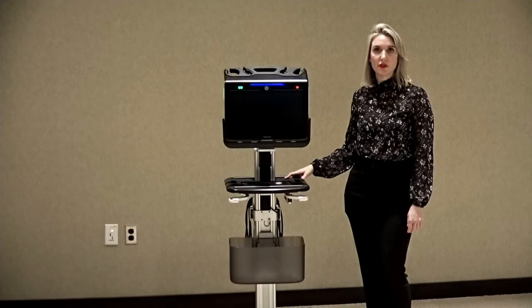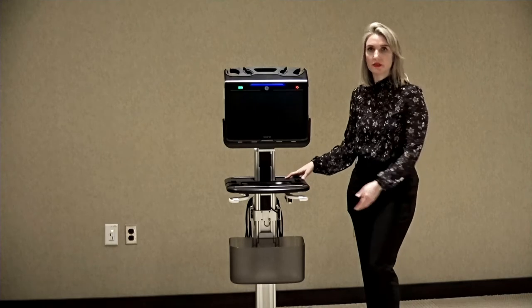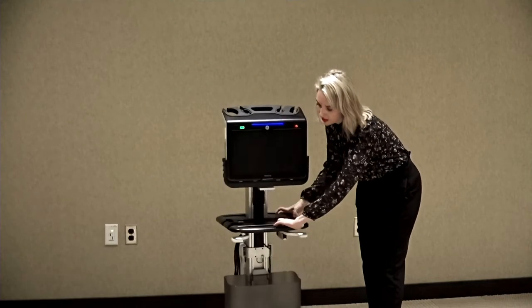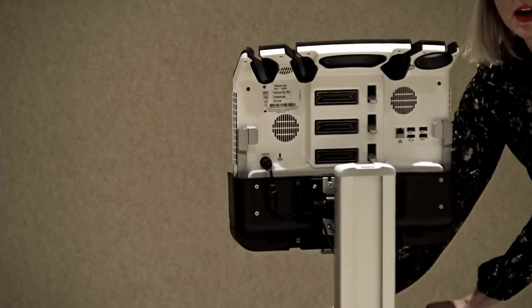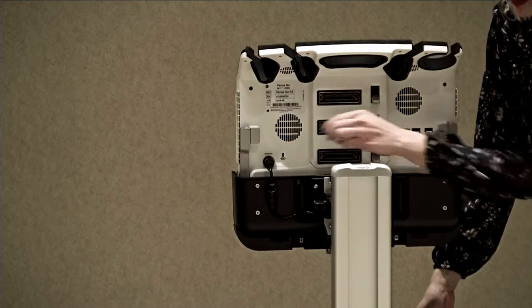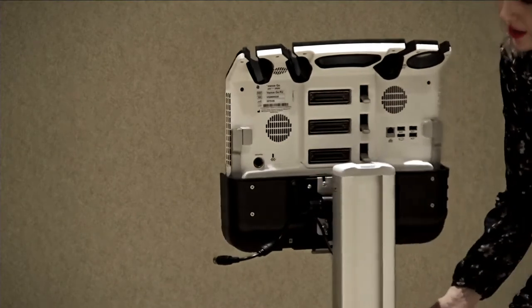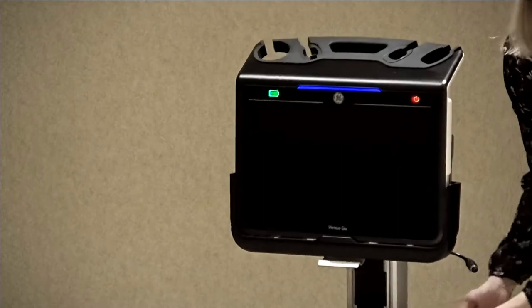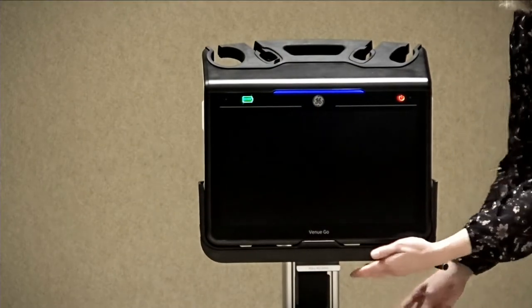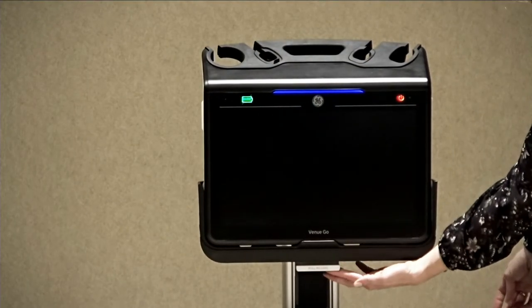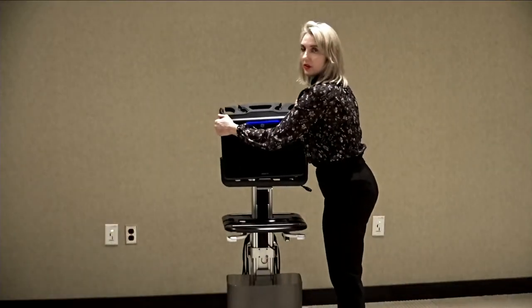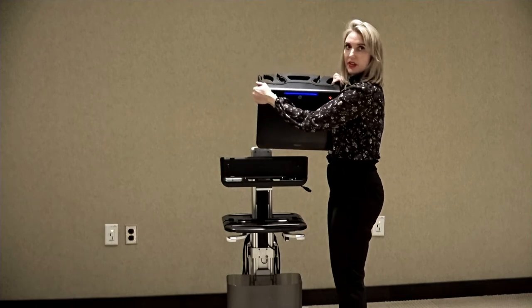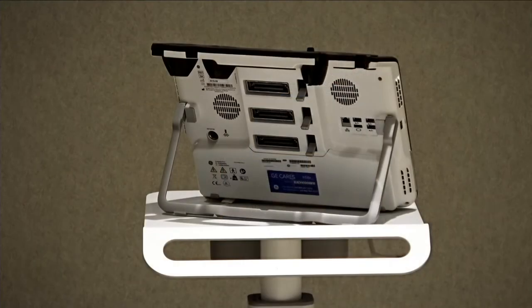To remove the Venue Go from the cart, lower the cart. Unplug the power cord from the back. Pull the release mechanism. Pull one side of the monitor, then the other, until the Venue Go is released. It can then be placed on a flat surface using the kickstand in the back.